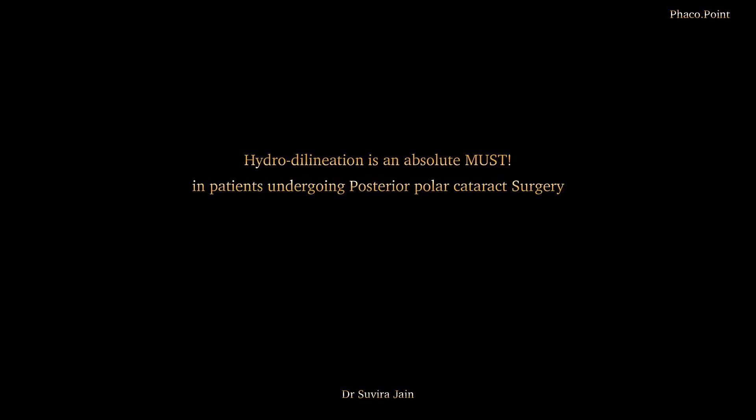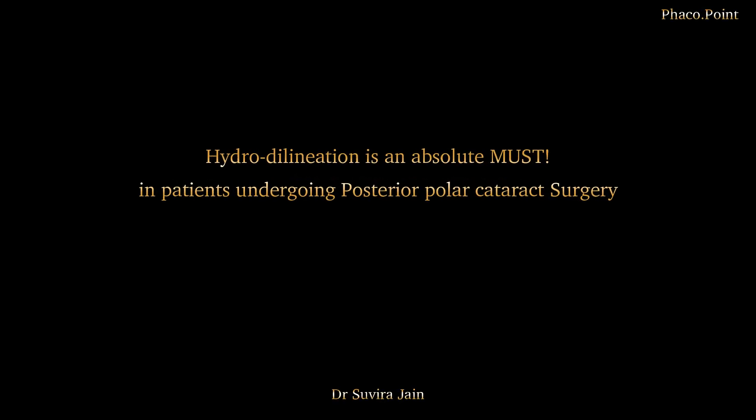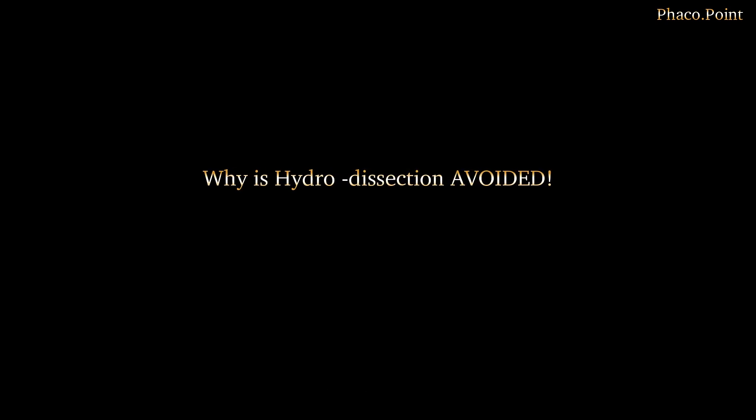In a patient with a posterior polar cataract, we always need to do a hydrodelineation. The reason we avoid hydrodissection is because if the hydrowave went between the posterior polar opacity and the posterior capsule, there is a significant possibility of the posterior capsule giving way. Therefore, we perform a hydrodelineation wherein we delineate the endonucleus, which then needs to be downsized and emulsified.